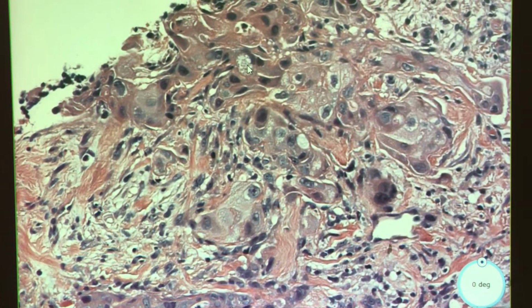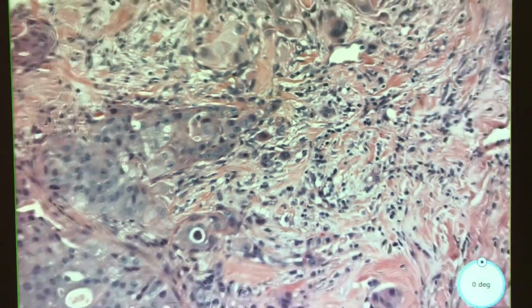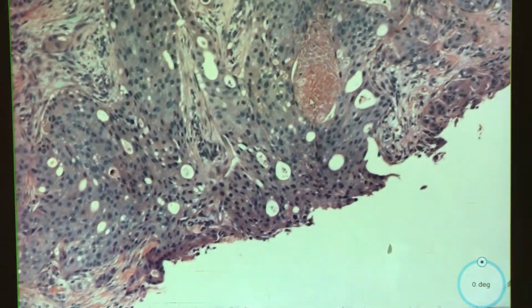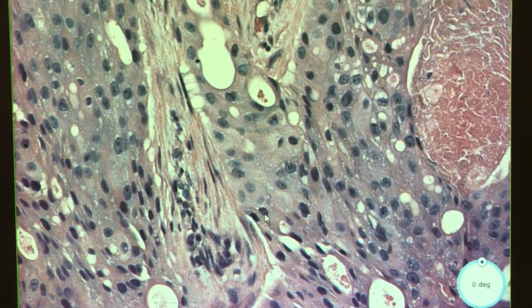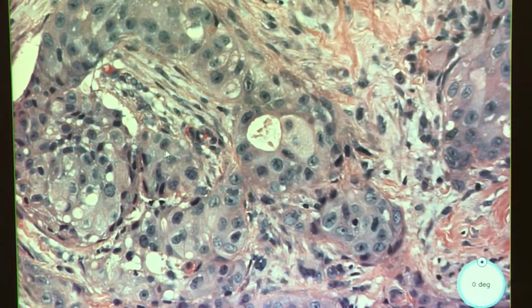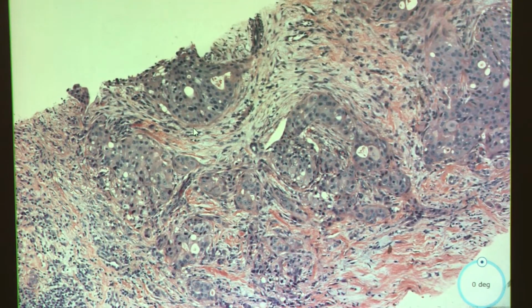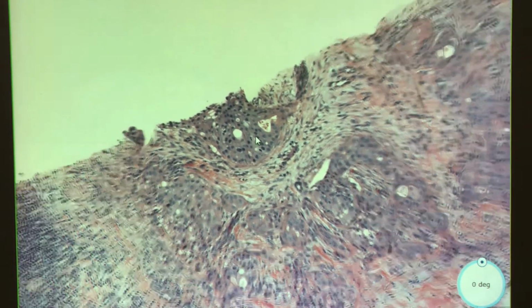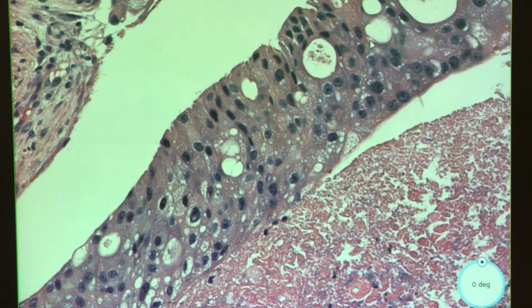But one of the other things that you should think about is your metaplastic carcinomas. So looking at this, that looks like keratinization. So you could go one or two ways with this one, I think. This could either just be a squamous cell carcinoma, metaplastic squamous cell carcinoma, or adenosquamous. Kind of looks more squamous. I think it's trying to confuse us maybe with this, where we have like a little bit of dropout.